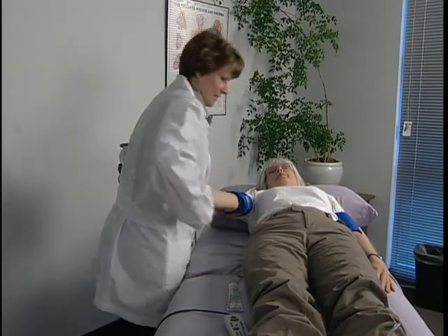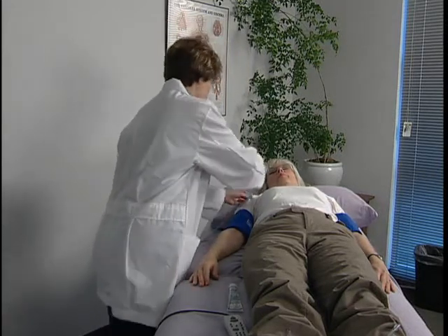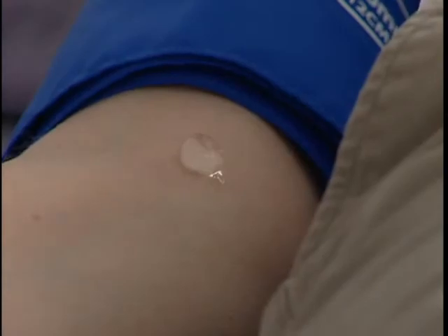Wrap a cuff at each arm and ankle to prepare for the exam. Use the appropriate size cuffs based on the circumference of the limbs. Start at the right brachial artery site and connect the hose to the cuff. Apply gel to the right brachial artery site.